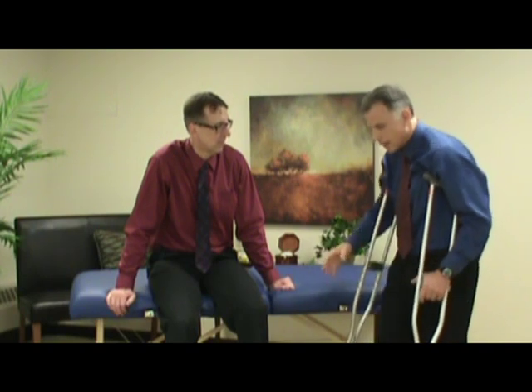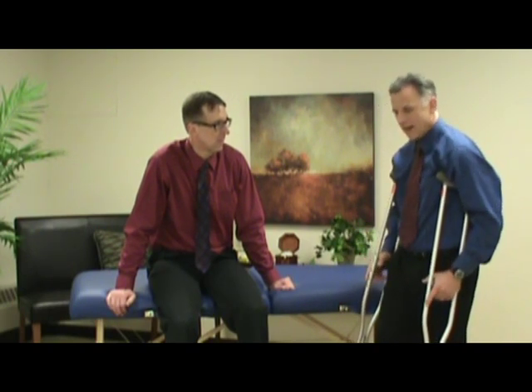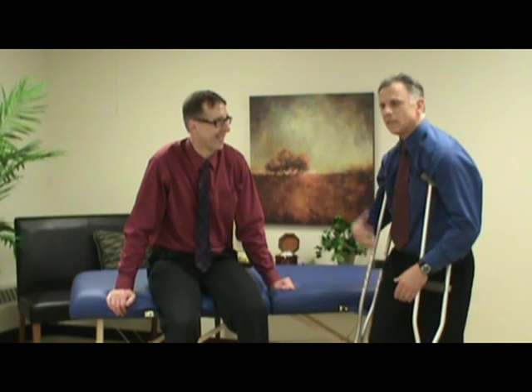Before we get into this, about a month ago I had a gentleman come in with a bad knee injury. It was serious and he couldn't put any weight on it. He came in with his crutches, and his were too low and I could see it right away. He'd been walking around like this. He says, I'm starting to get a backache and my knee's hurting. So the first thing we did is adjust the crutches.